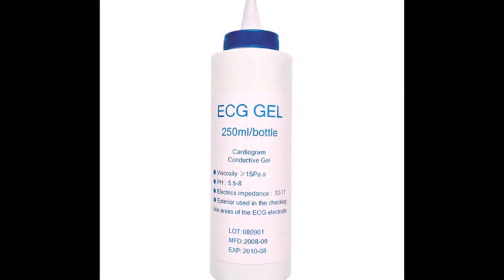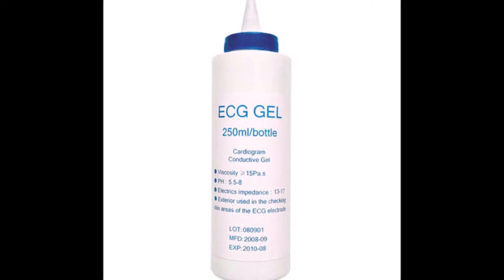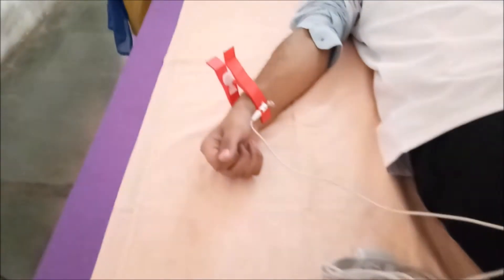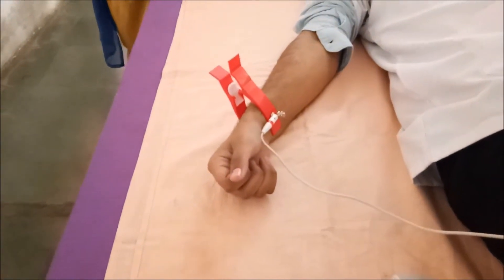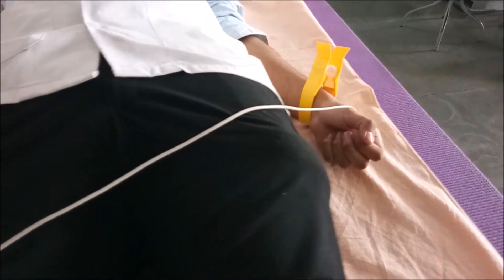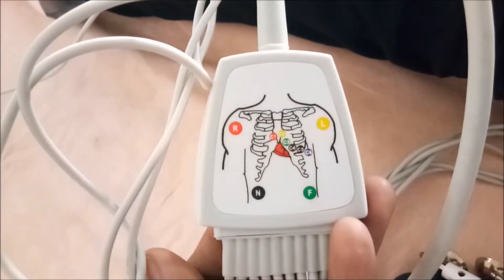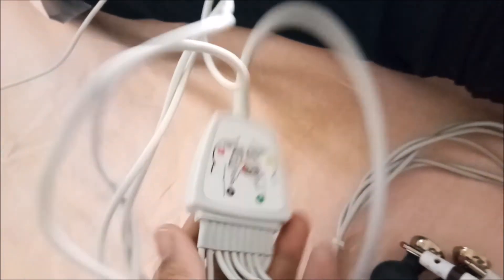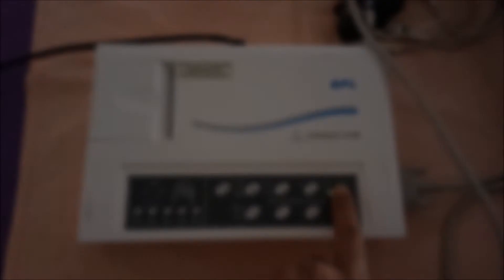Don't forget to apply the gel before connecting the electrodes on the surface of the body. There are total 12 leads — an arrangement of wires with a pair of electrodes. Here you can see how to attach the electrodes, and there will be a knob giving identification of where to place the electrodes.